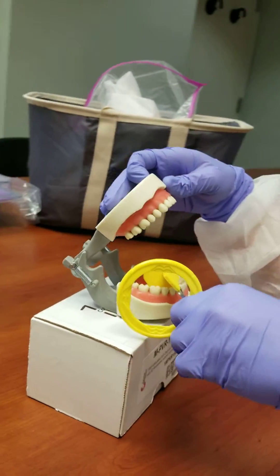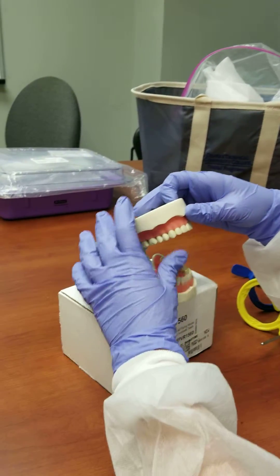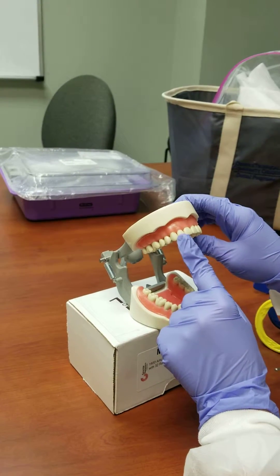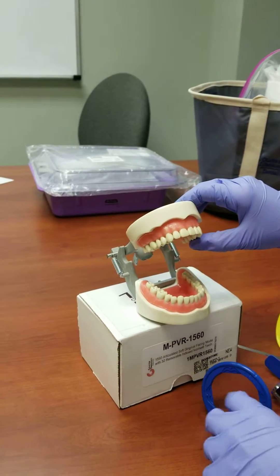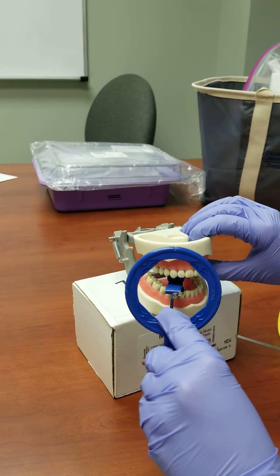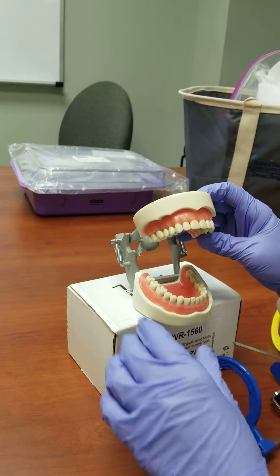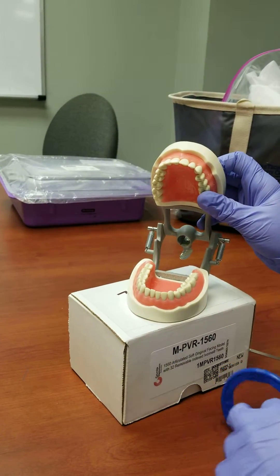Then I'm going to do a PA of number 7, which is the right maxillary lateral incisor, right here. Then I'm going to do number 22, which is the left mandibular canine, right here, the PA.